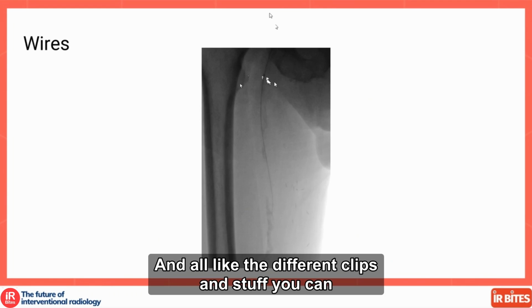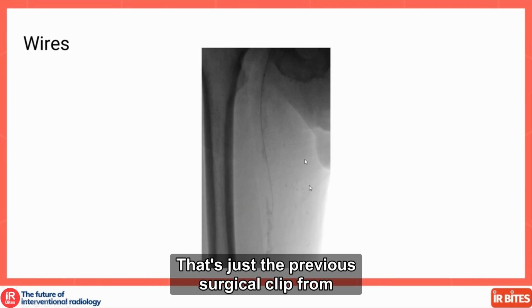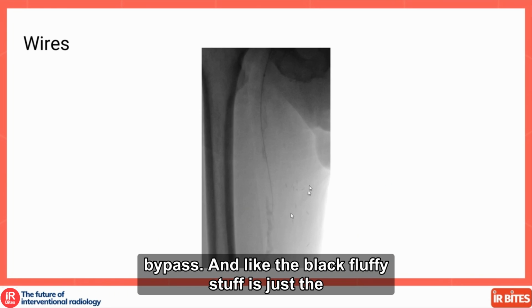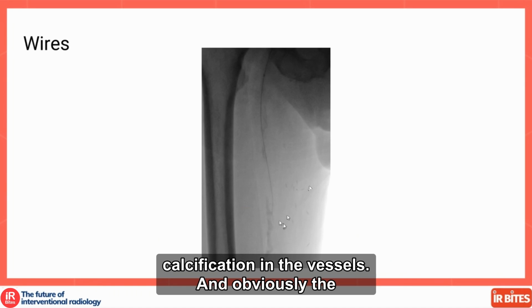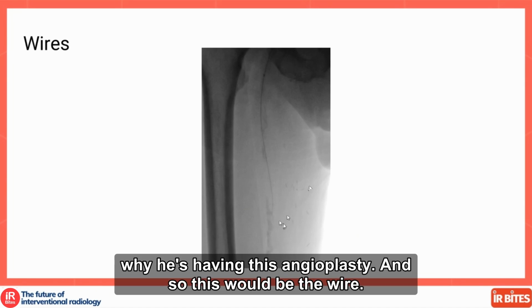And all the different clips you can see further down in the medial aspect of the thigh are just the previous surgical clips from bypass. And the black fluffy stuff is just the calcification in the vessels. Obviously the patient has some peripheral artery disease. That's why he's having this angioplasty.